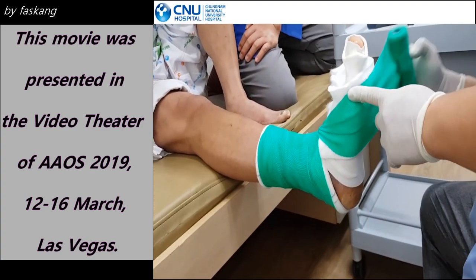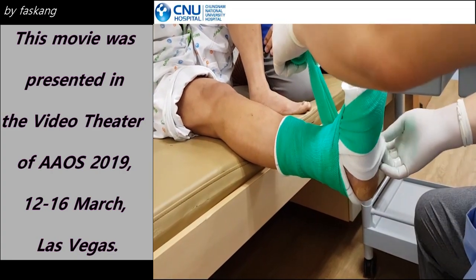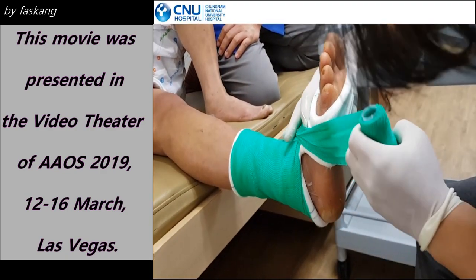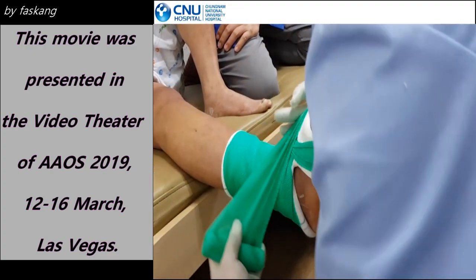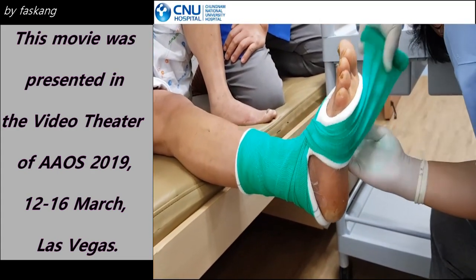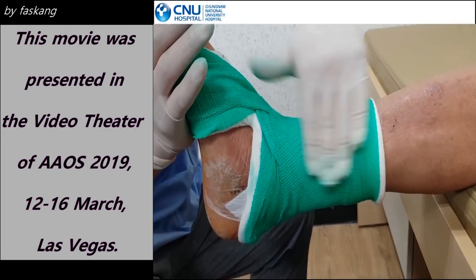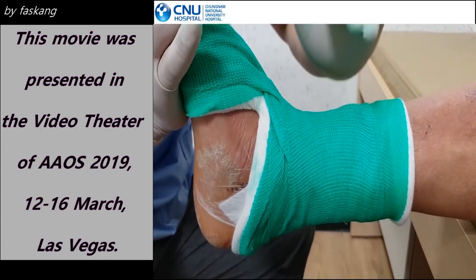This video was taken from another different view during the covering process of the foot. While the assistant holds the cast, the sleeve and cotton are modified. The cast should be in shape to maintain coverage of the mid portion of the medial longitudinal arch through the metatarsal phalangeal joint. Especially for the foot portion, it is carefully covered without tension since overtightening can cause compression of the medial and lateral forefoot, leading to pain and discomfort. Loosening of the cast after decrement of edema and muscle wasting can cause pain on the anterior aspect of the lower leg. To prevent this, flattening the tibial medial surface and the anterior compartment to make a free space between the tibial crest and the cast is essential.